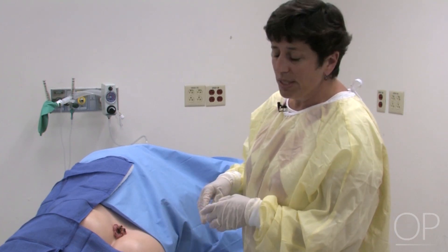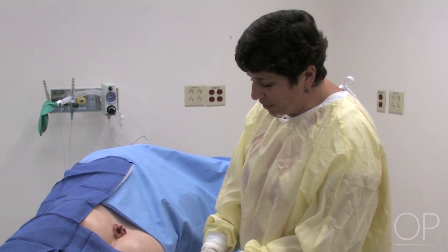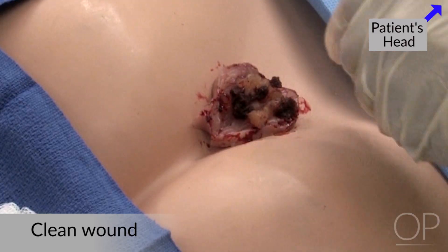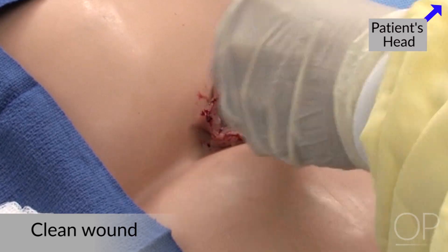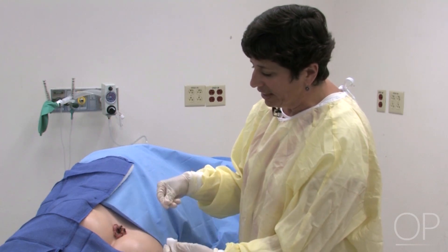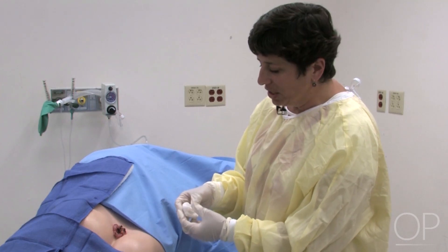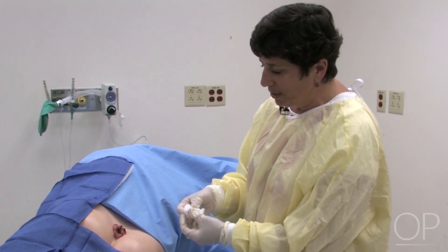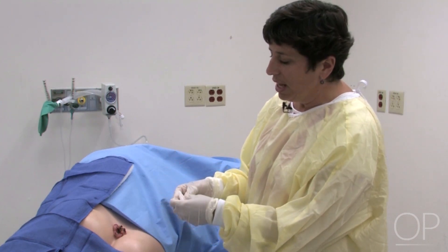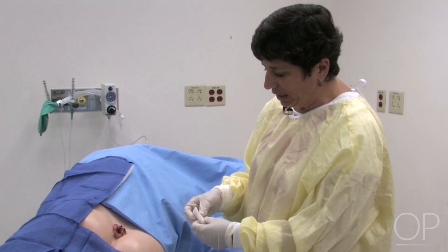The next thing we want to do is clean up this wound, and then we're going to choose a dressing to help heal it. Wet normal saline gauze is good for cleaning wounds. You want to use some pressure to clean off any dry skin or areas that are dead, dry, and flaky. If it bleeds a little, that's actually a good sign that there's healthy, viable tissue there. If you push too hard on the wound, you may actually disrupt the wound bed, so you want to use some pressure but not aggressive pressure in cleaning the wound.